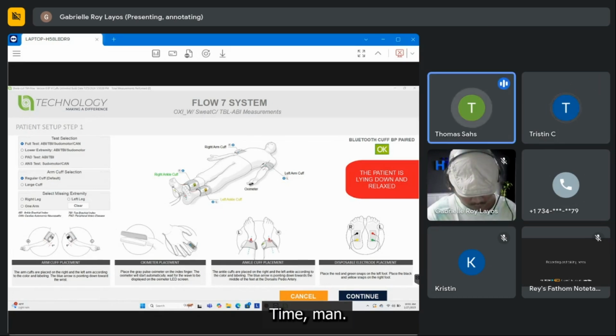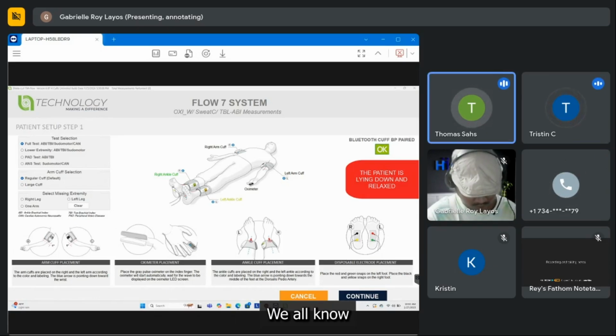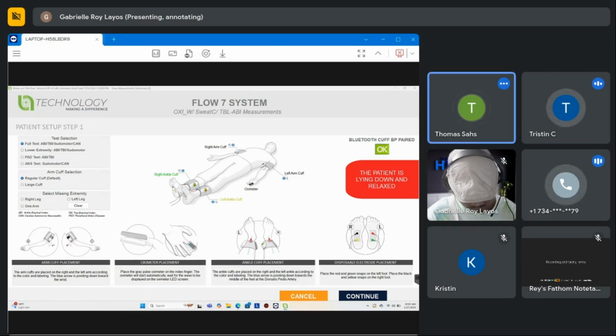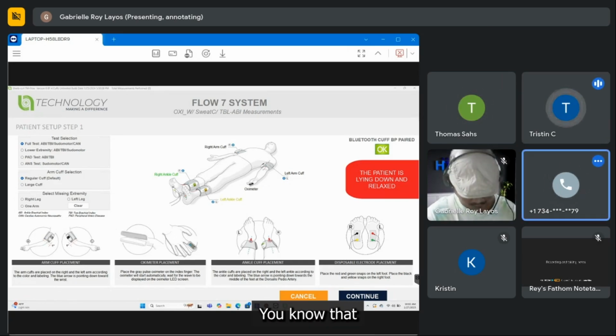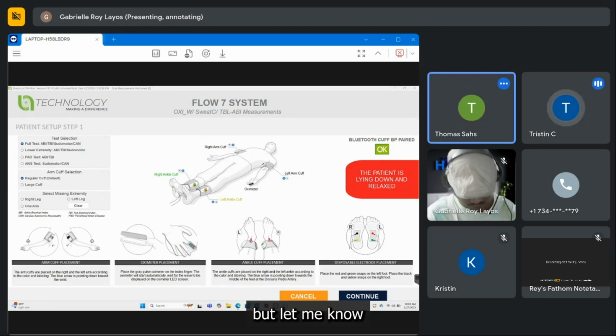We'll go over report interpretation, not billing, correct? If you want to train and have somebody on, we can do that as well. I'm really not allowed to be doing billing training, so that's fine. We're just going to go through the report. I was going to have Dr. Merrick do the report. That's fine. I would have said something. Will you tell Nina to step away? She's getting her papers. Okay, let me. On training.